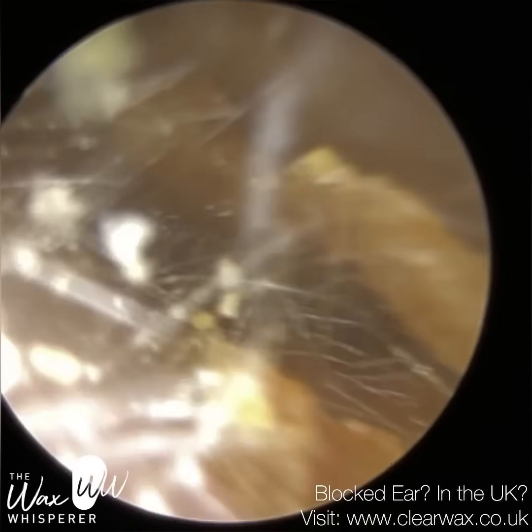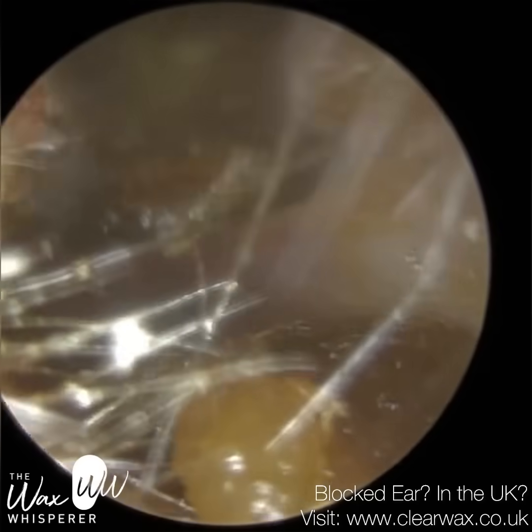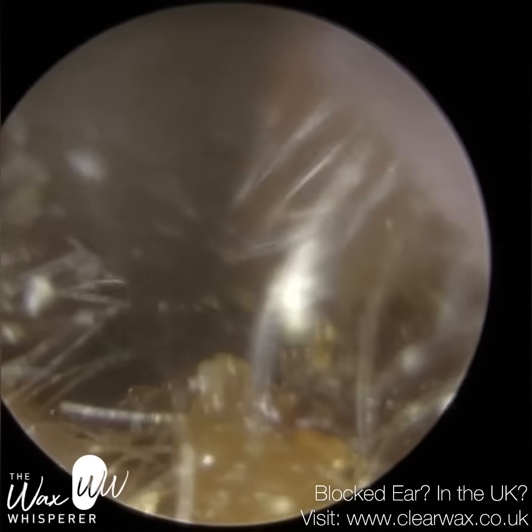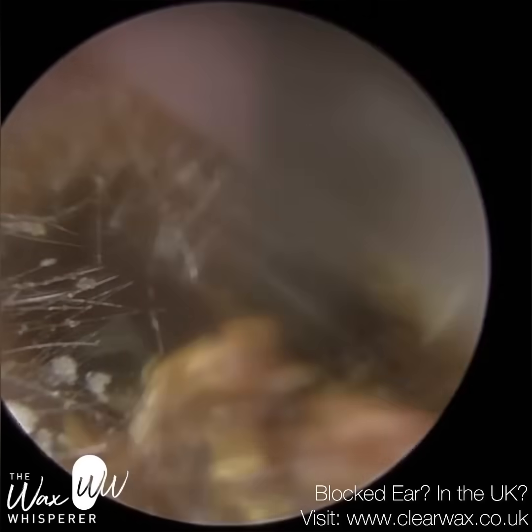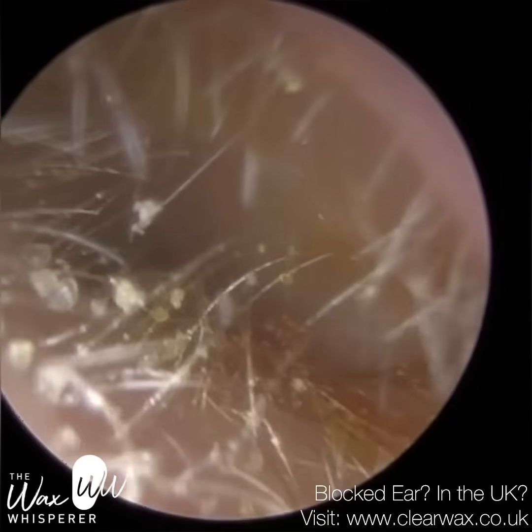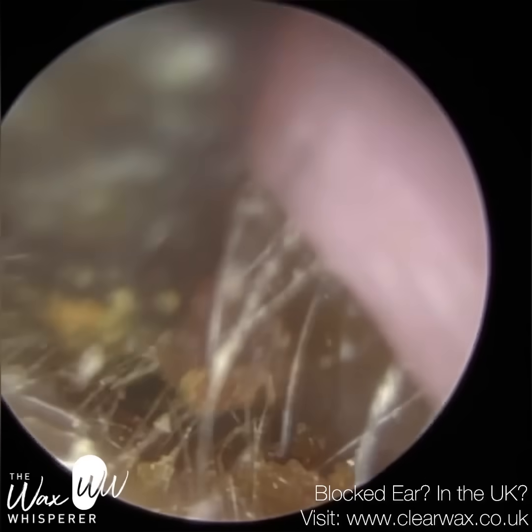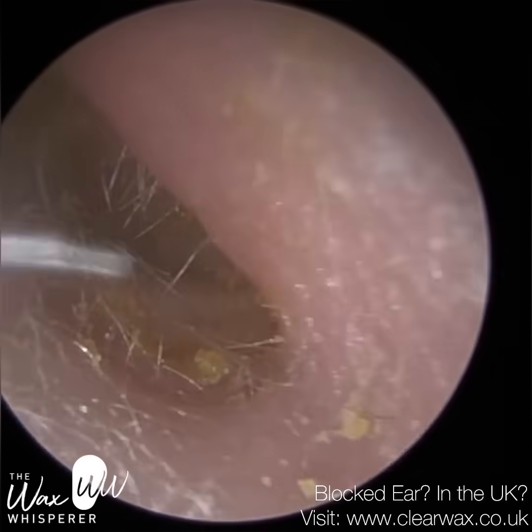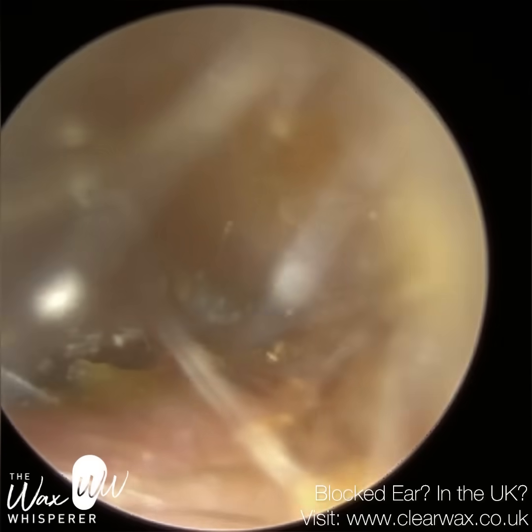You may have also seen the curvature of the Rykerette — I've put a little curve in there to mimic the curvature of the ear canal, which makes removing soft sticky wax off the canal wall far more comfortable for the patient. All other Rykerettes and Jobson Horns that I've used are straight with no curvature at the tip, so when you're gliding it against the canal wall, which is slightly rounded and curved, it creates more friction and can be a bit more uncomfortable. This is their left ear, which always has less wax — there was a partial occlusion, so I'm just mopping it up. They don't have any symptoms per se, but I might as well just remove some of the bigger lumps, and you can see how well the Rykerette is moving and gliding across the surface of the canal wall.